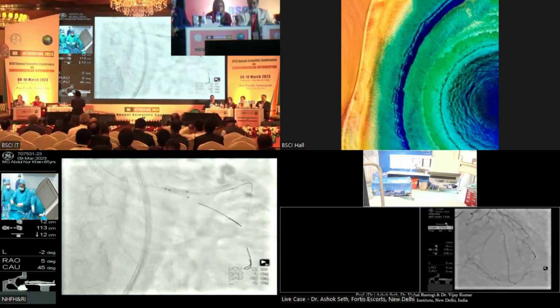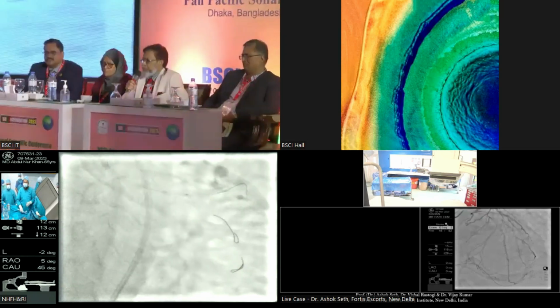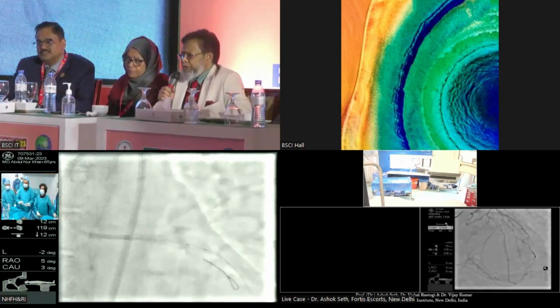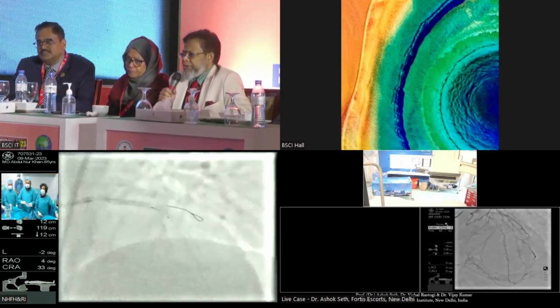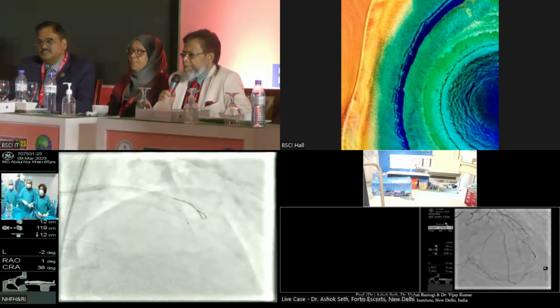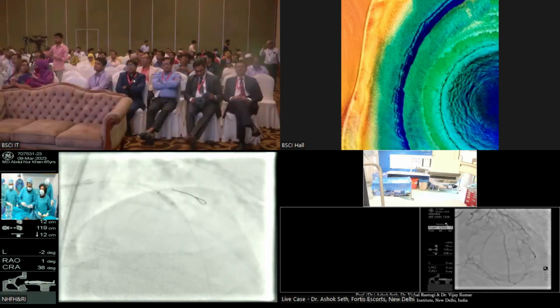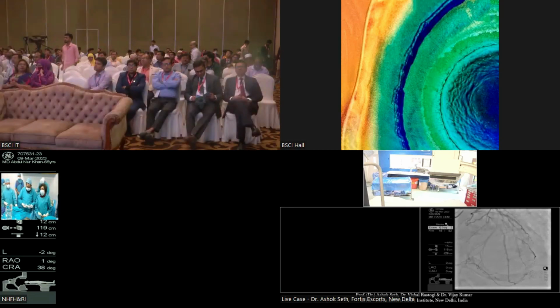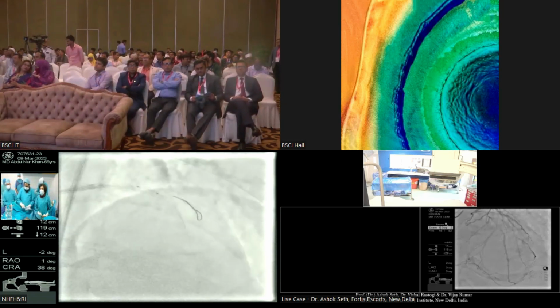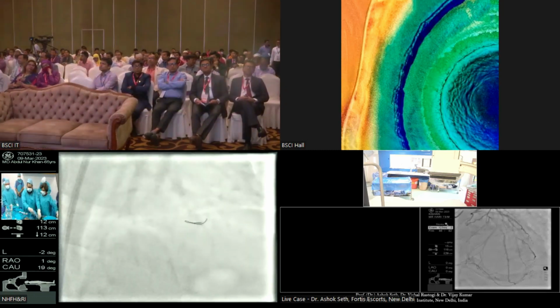And we will be doing the IVUS as well. Let's see. Almost finished. Work is almost finished. Now, final POT and then finish, IVUS, then finish. Yeah, so they need to see the angiographic picture as they're leaving. So we're doing a bit of post dilatation. So they want to see a picture. Yeah, so let us show the picture first, and then we can always do the report and the check, please.